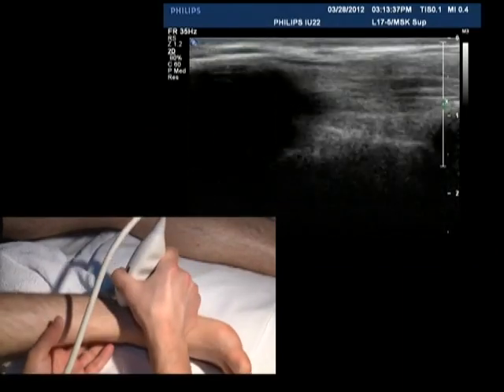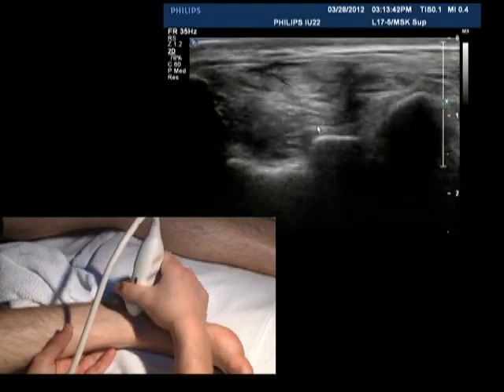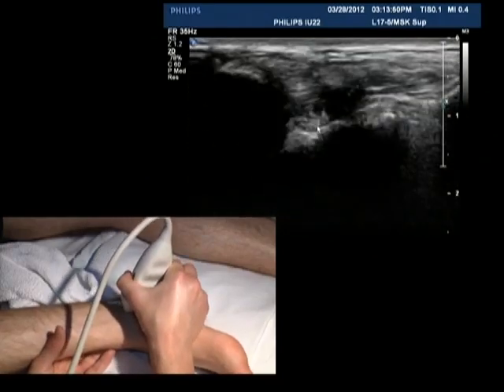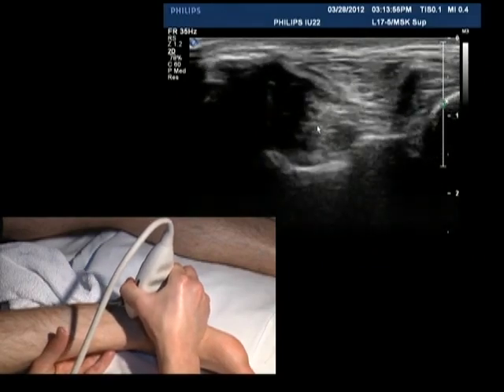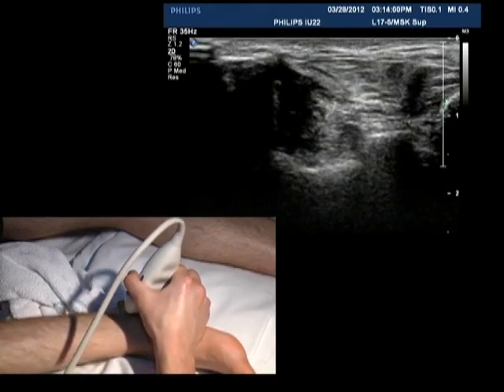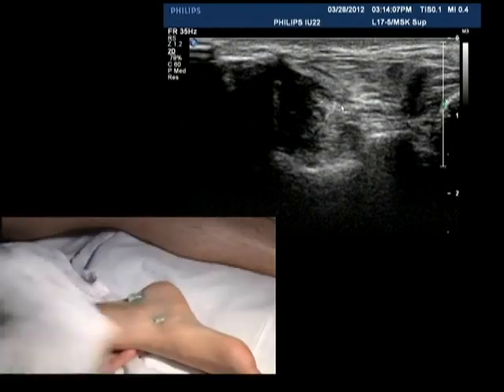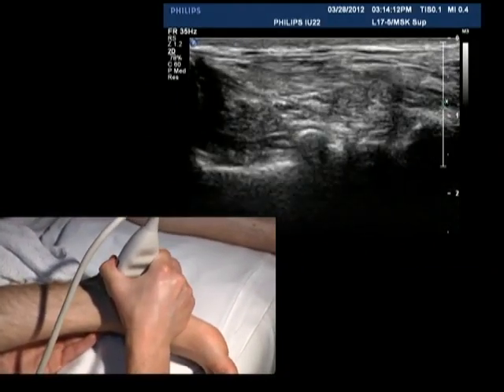But again, you'll see that the tendons in the short axis, if you follow them, so if you're coming on the posterior tibial and you follow in the short axis here, coming down to that navicular, you can see where the deltoid ligament would reside. It's going to be right in that area. You can see some of the fibers deep right there. Again, can you freeze that for me? You can see some of the fibers here somewhat deep, but his was a little bit amorphous, so I knew that he had injured it at some point. Thank you. Again, there's a little portion of it right there.